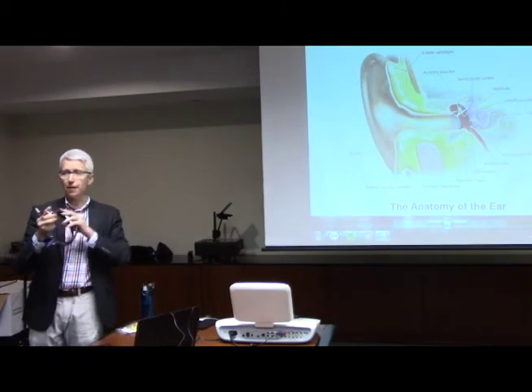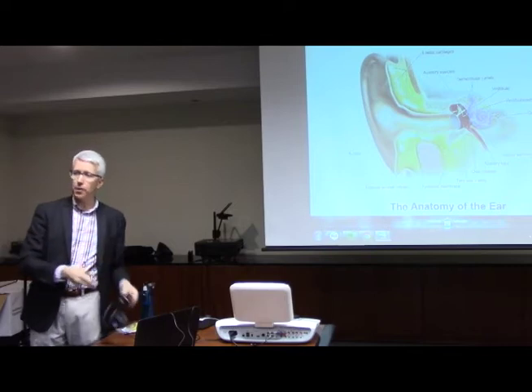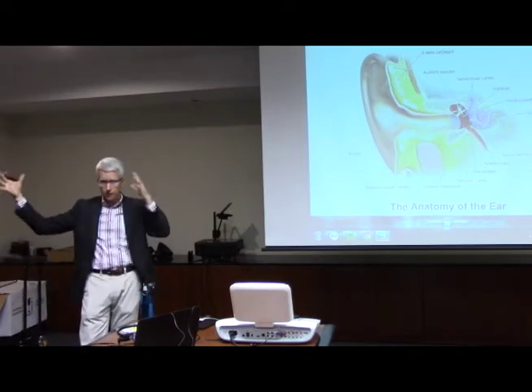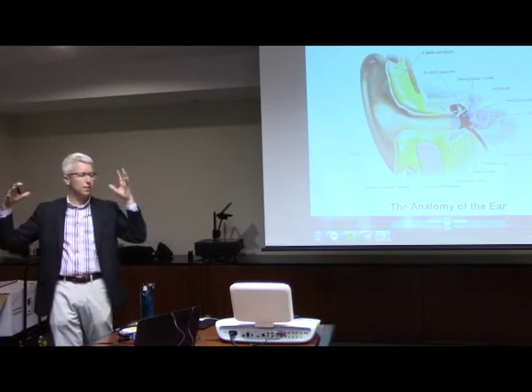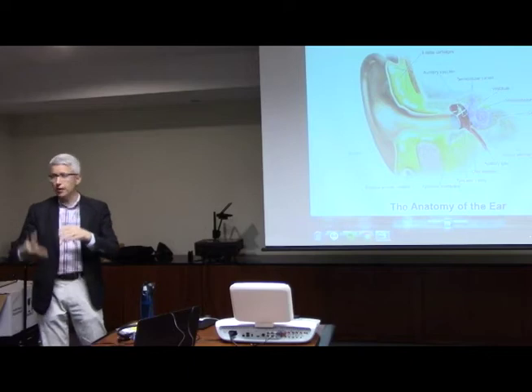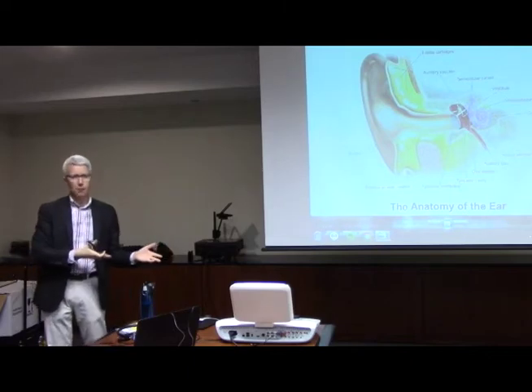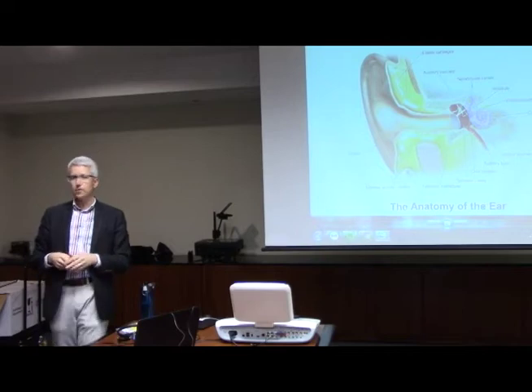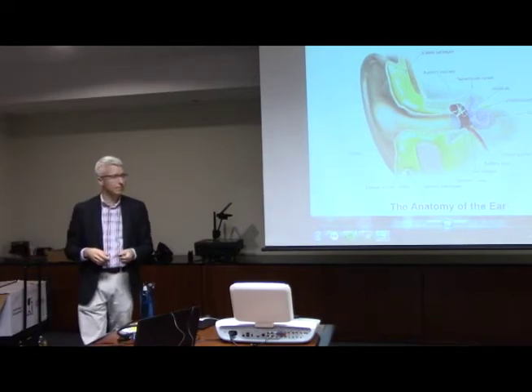Well, that's done at the factory on a new one. Well, when we sell speakers, you can't calibrate those till they're installed because that may change some different dynamics of the way of the whole system. And so in that case, that's when I have to have a technician go out with me. So in addition to spending $10,000 for the audiometer, they're spending another $500-600 for installation and that kind of thing as well. So we do some of the calibration on site.